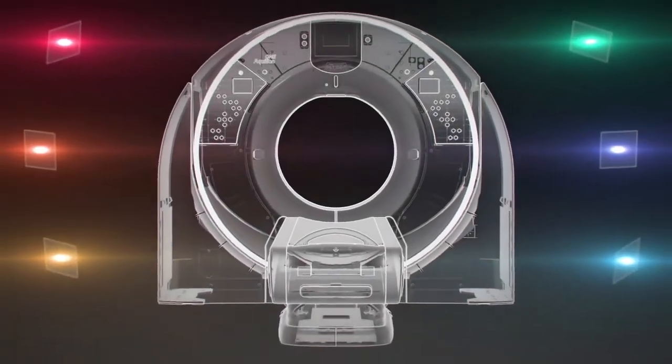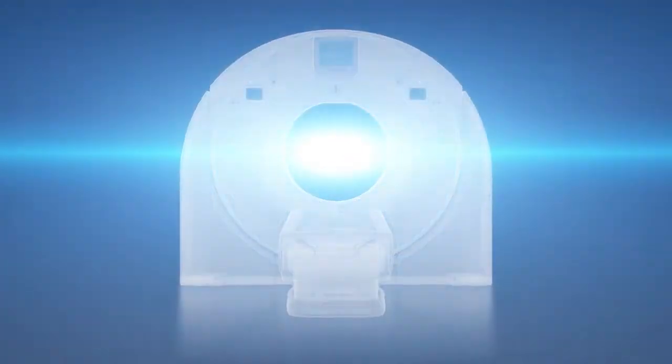With the new Aquilian-1 Prism Edition, Deep Intelligence is integrated into every scan for every patient. Now and long into the future.